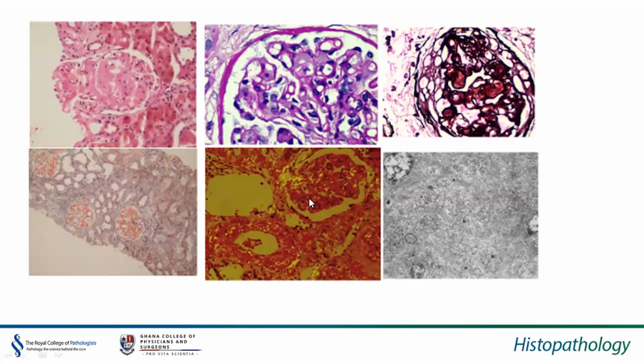So with that, we move on to this, which all of you will find very easy to recognize: this type of pale material present within the glomerulus, very light staining. It's almost as though it's flowing within the mesangium. It is present here as a nodule. It can be present along the capillary walls. It is here subtle in amount. This is faintly PAS positive. It's never intensely PAS positive. Look at it here, just along the capillary walls.